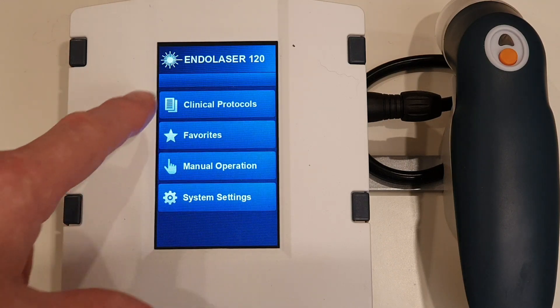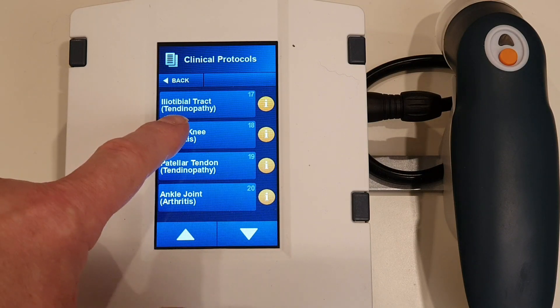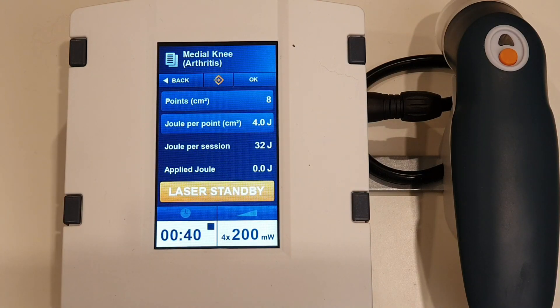We're going to come into clinical protocols and then just look down until we see the knee. It says medial knee arthritis — it's the same if you're doing the inside or the outside of the knee; it doesn't really matter.